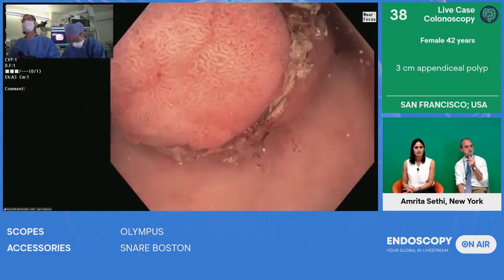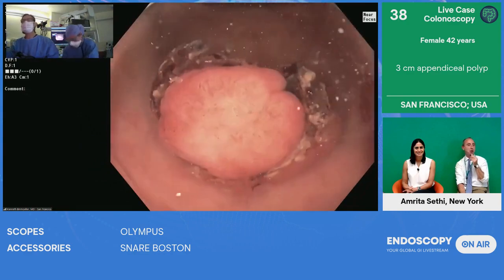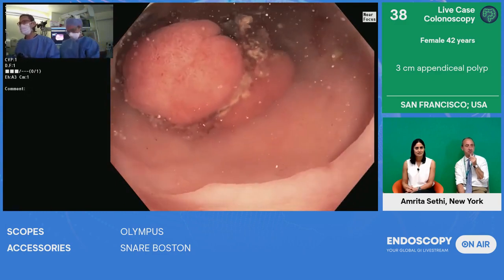Cold. I don't want to do cold. The reason you don't like cold? It looks like a small spot that are maybe 5 millimeters or so. 20 would be fine. I think 20 will work, or 25 maybe. Let's see.